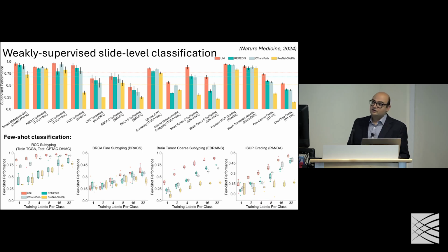There have been a lot of foundation models since, and the performance of these models is beginning to saturate, but it's important to also see that few-shot performance has improved significantly over the years. I mean, back in 2019, we were looking at using 10,000 slides to try to capture performance that one would get with pixel level annotations, all the way up to more recently, where you can use a few slides in a few shot manner and still get clinically useful performance.